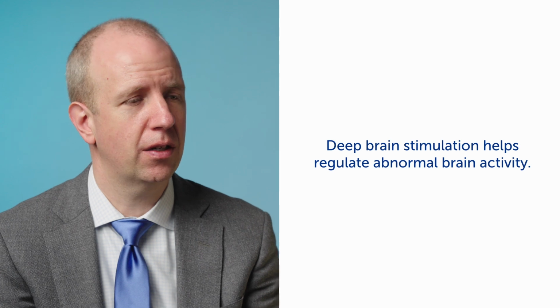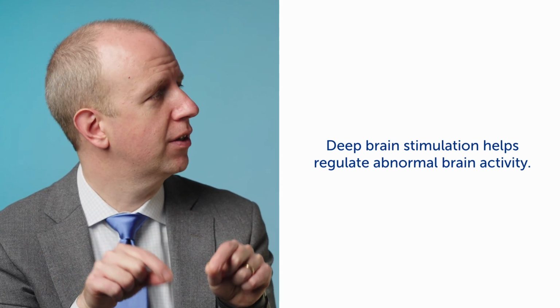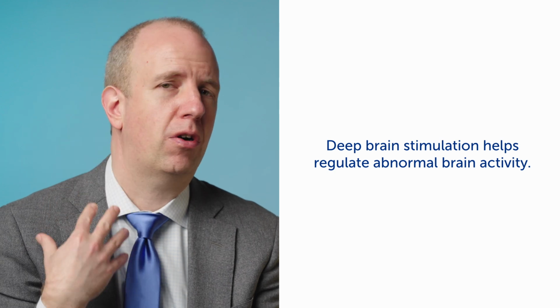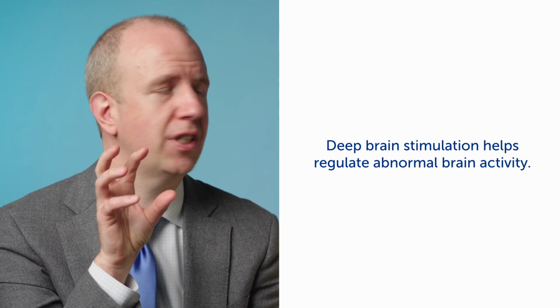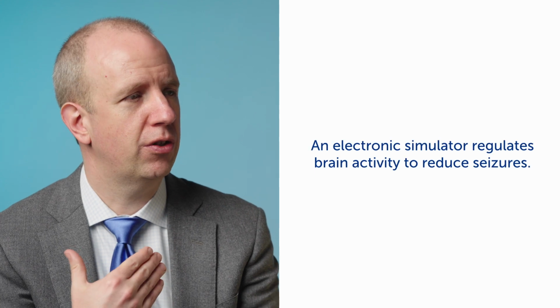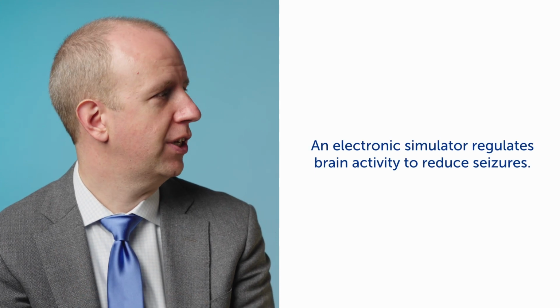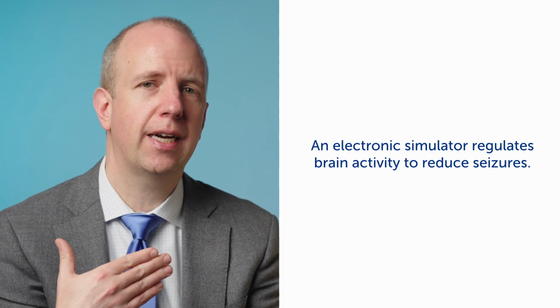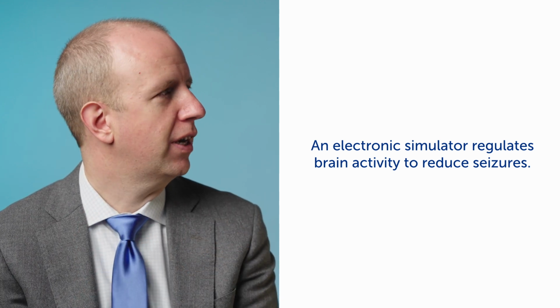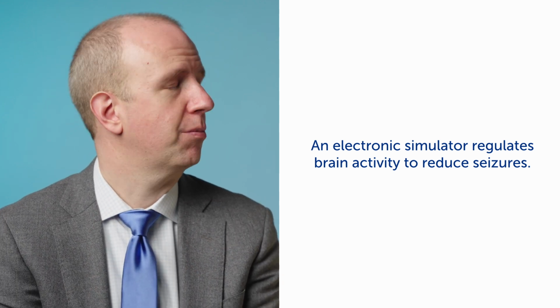I like to think of it a little bit like a pacemaker, kind of like a heart pacemaker, but for your brain. It's a device that includes electrodes that are placed into very precise targets in the brain, which are connected then all under the skin to a little stimulator, which contains a battery and electronics, and it allows one to deliver electrical stimulation to the brain in a way that is designed to actually modulate or influence the way the brain functions and try to stop seizures from happening.